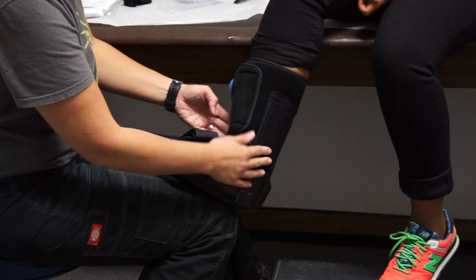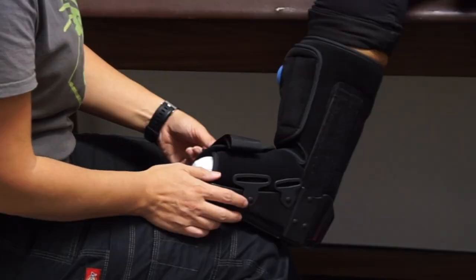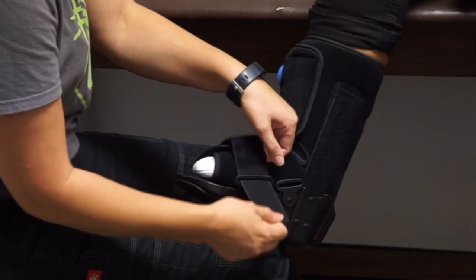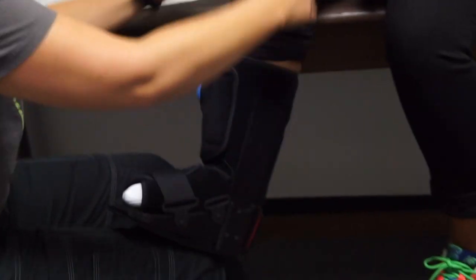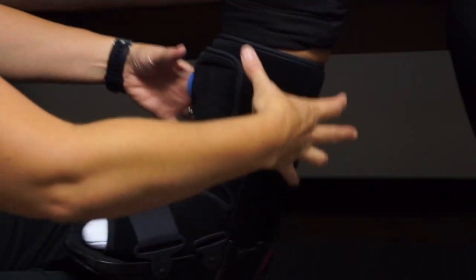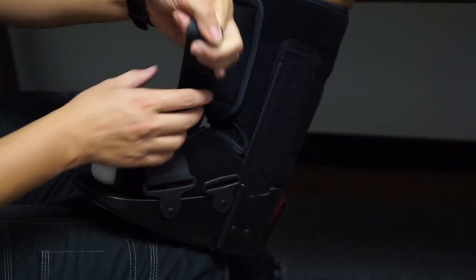Now that the boot is attached to the liner, we put on the velcro straps, starting with the most distal strap. I always tell people 'toes towards your nose' — because we want to get that swelling out. We never go proximal to distal, as that would push all the swelling into the toes.